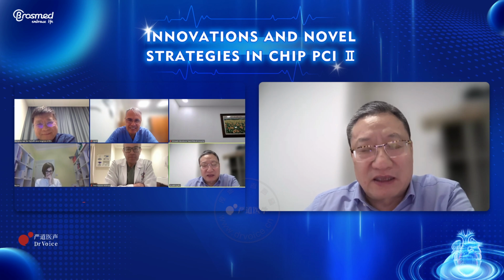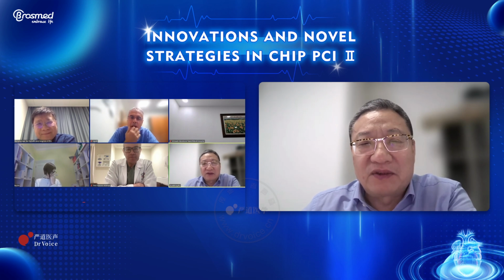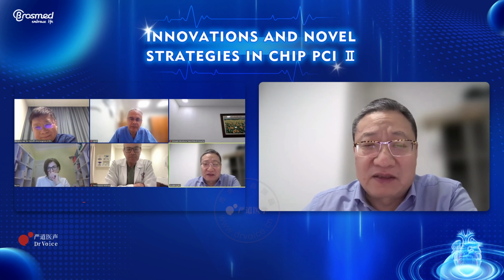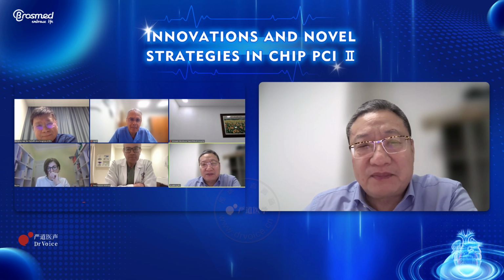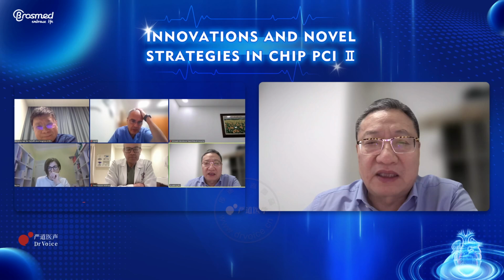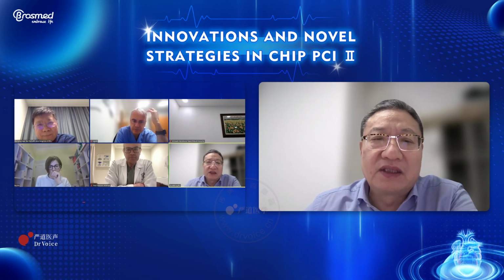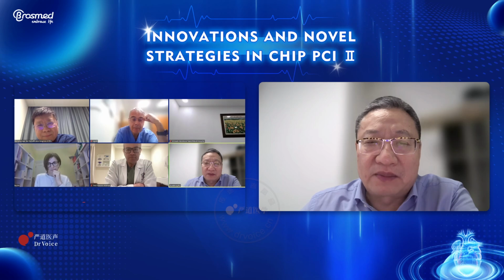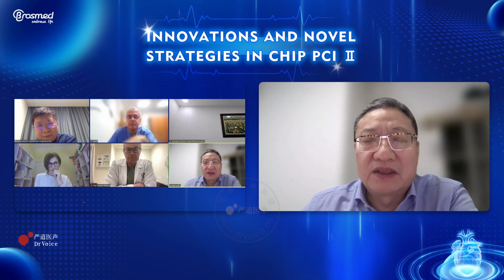Chu did a lot of experience in de novo lesion, used the DCB. And for these cases, I think it's really successful, pre-treated with cutting balloon and get very good immediate results. So use the DCB. It's a very nice choice. I think especially for patients, and it's very good.